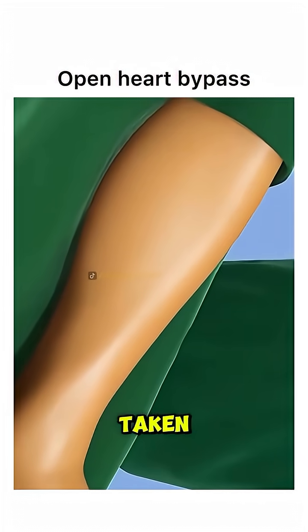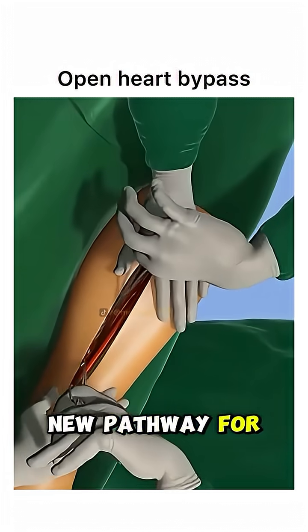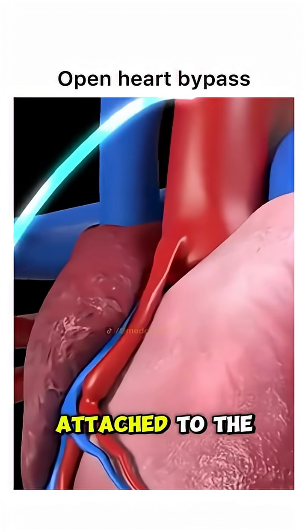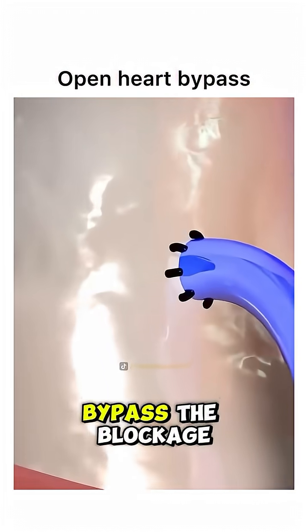Next, a healthy blood vessel is taken — usually from the leg, arm, or chest — to create a new pathway for blood flow. This graft is attached to the coronary artery, just before and after the blocked section, allowing blood to bypass the blockage.